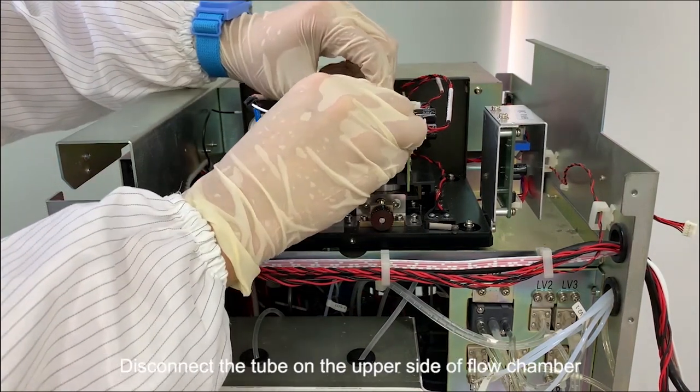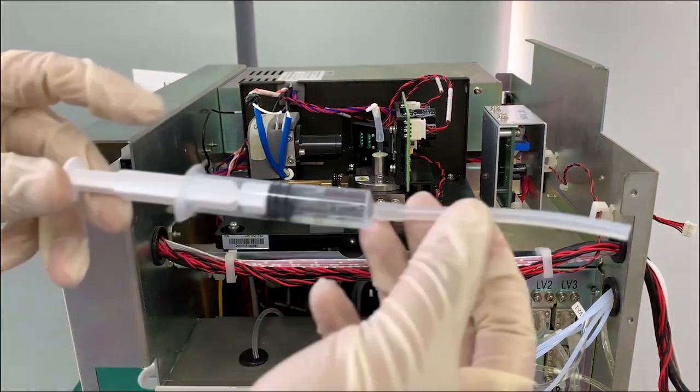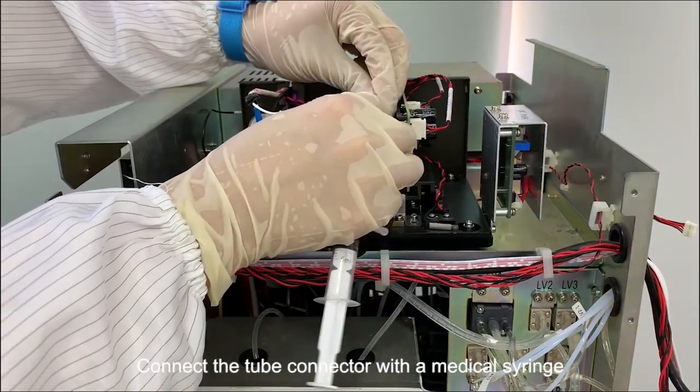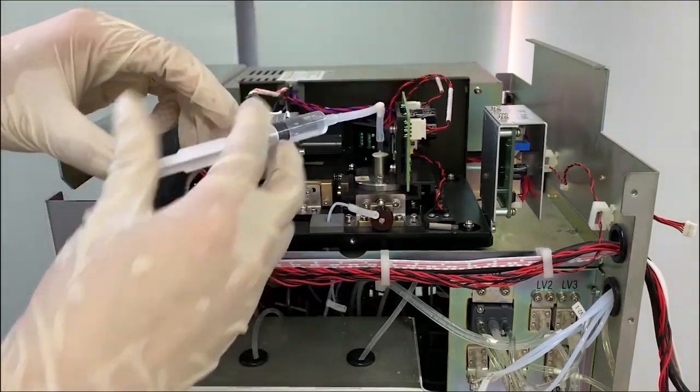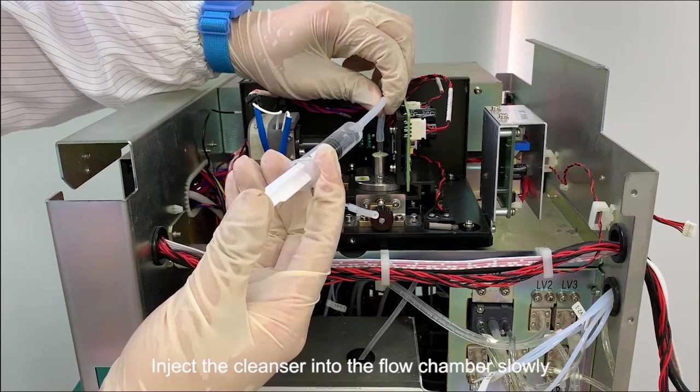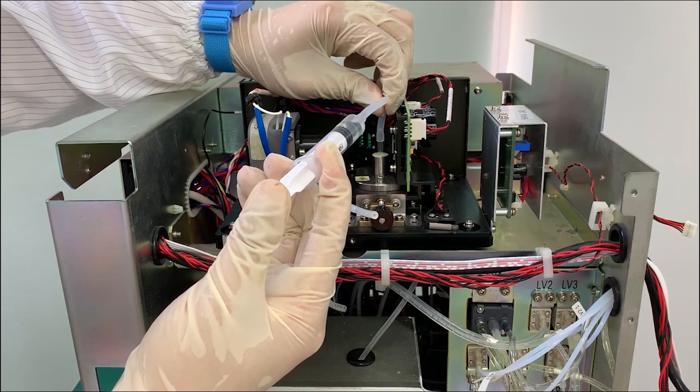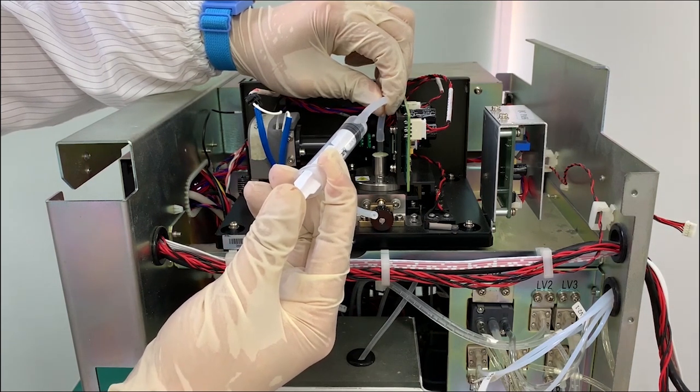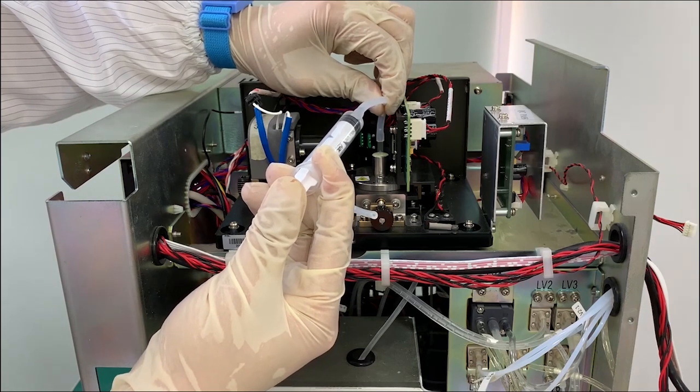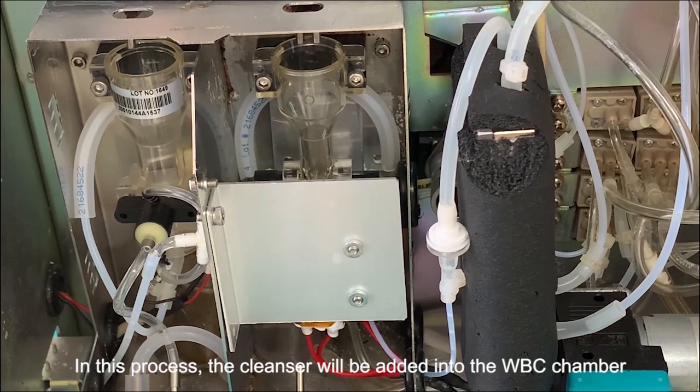Disconnect the tube on the upper side of the flow chamber. Connect the tube connector with a medical syringe. Inject the cleanser into the flow chamber slowly. In this process, the cleanser will be added into the WBC chamber.